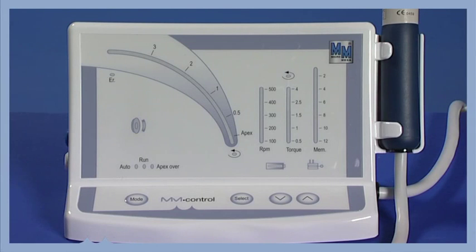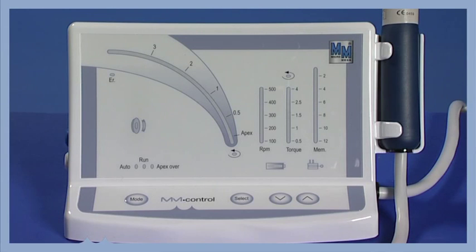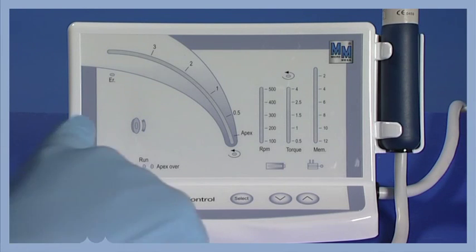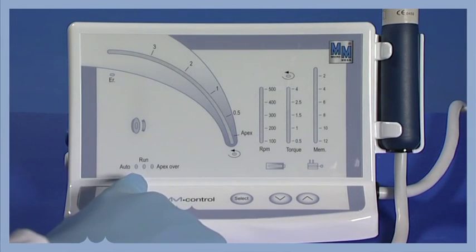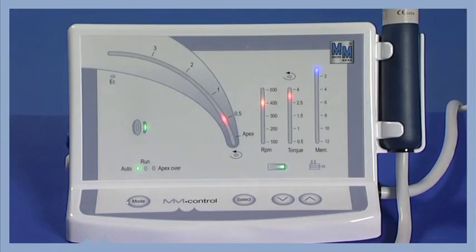MMControl, the new endomotor with torque and speed control and integrated apex locator by Micromega, is the indispensable tool for endodontic treatments ensuring safe and simple root canal shaping. To start, simply press any key on the device's front panel.